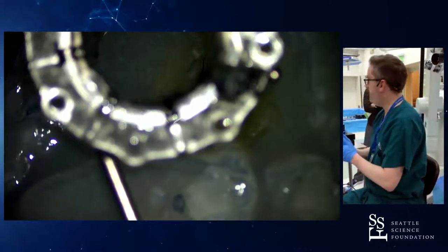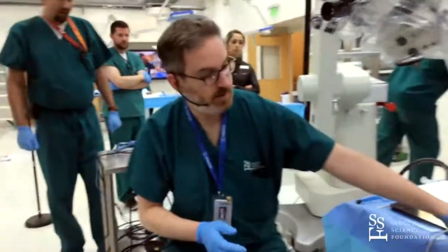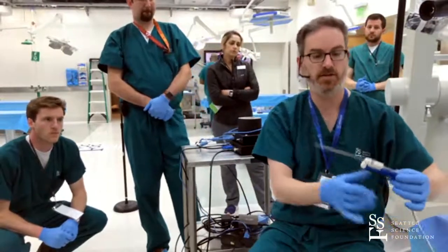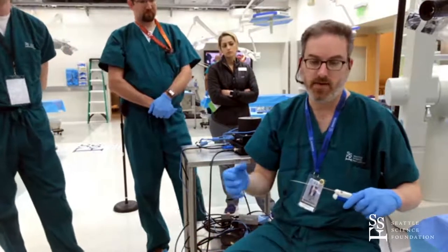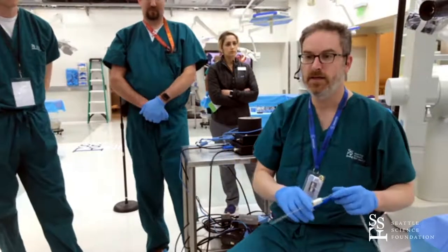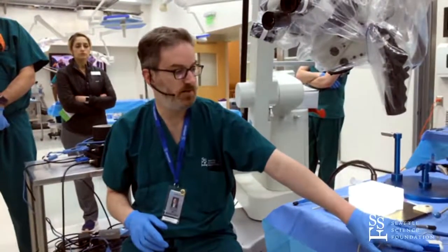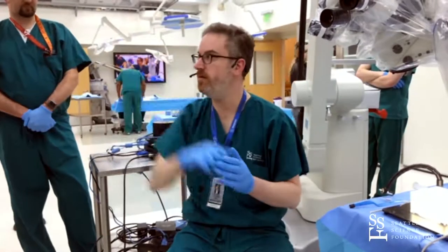You take the trocar out and the first thing you do is drop this down and make sure you're directly on trajectory — that your nav wasn't off and you didn't roll off the side. You can do a little bit of course correction but not a tremendous amount. Regarding the Myriad settings: even with your foot off the pedal there's always a little bit of gentle suction to keep the system clear so things don't clog up in the tubing. They make handpieces that fit down the working channel of an endoscope. For intraventricular work I never go to 100 — I start between 50 and 60. For this type of case I probably start about 60 to 70 and dial up and down as needed. There are also different gauge handpieces — 11 to 15 gauge, jumping to 21 for endoscopic applications.